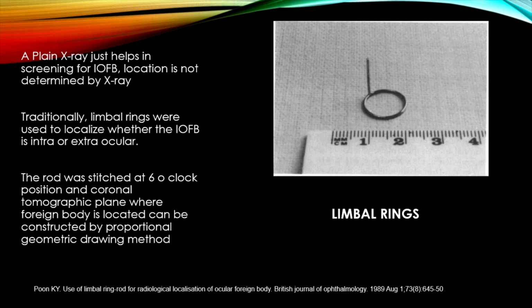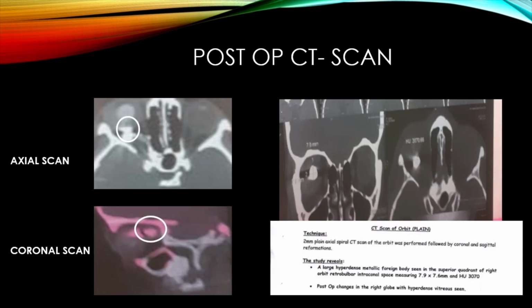What was the mistake? That the CT, yeah, for trilateral retinoblastoma, you said CT. Bilateral retinoblastomas. Huh? Bilateral. Yeah, but nobody does CT scan for retinoblastoma now. Okay, fundamental to that. This is what you should understand.